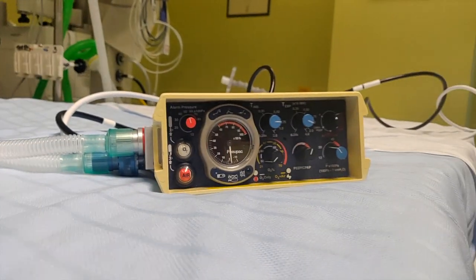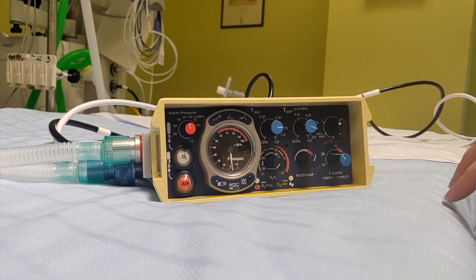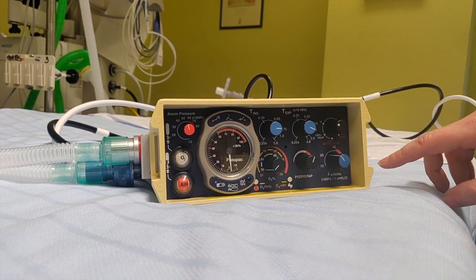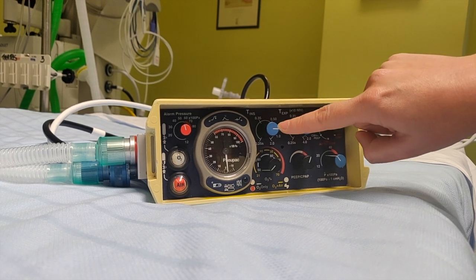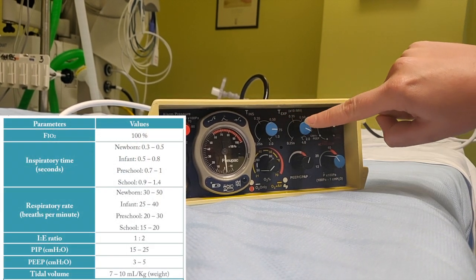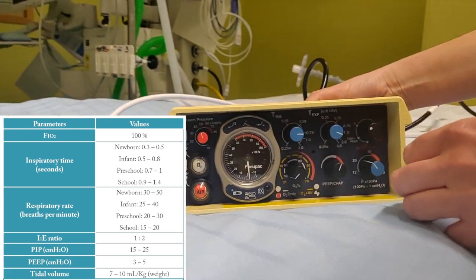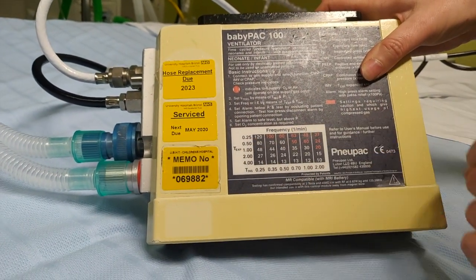So having spoken about the FiO2, let's go to the settings. How do we set up this ventilator? This ventilator is not very technical — we're not going to have many buttons. We're going to have to set up the rate with an inspiratory time and an expiratory time. The ventilator comes with a very useful guide on the top for that.